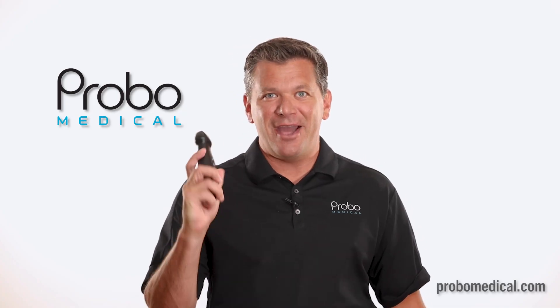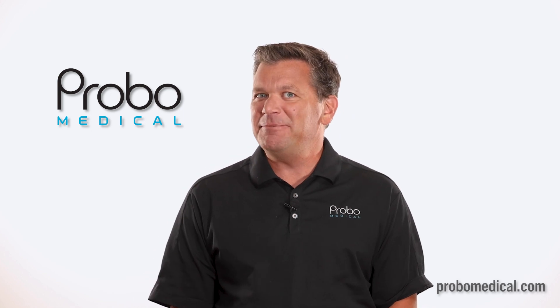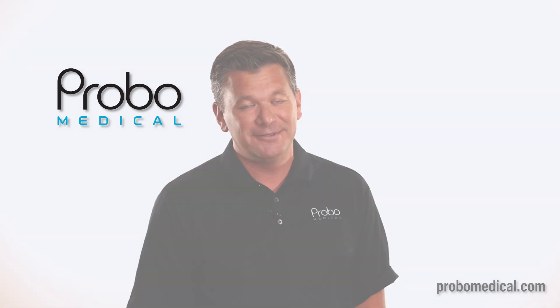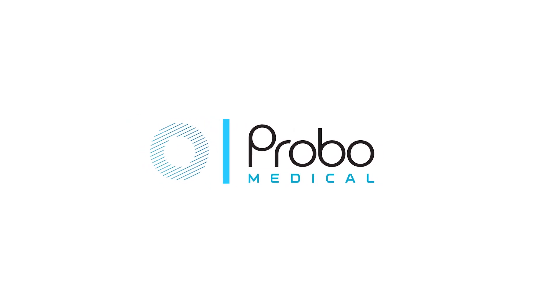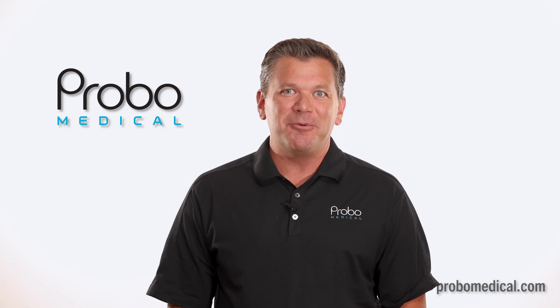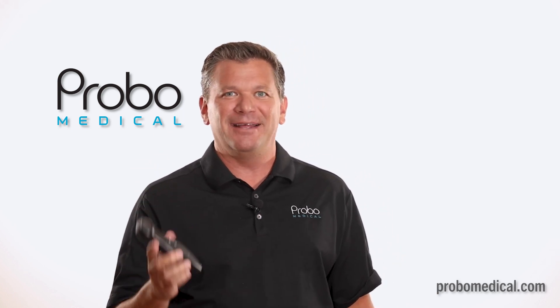It's the latest fad in ultrasound: the handheld. MindRay has entered the fray with the new TE Air. Hi, I'm Brian Gill with Probo Medical, and this is the MindRay TE Air handheld ultrasound device — whatever you want to call it.